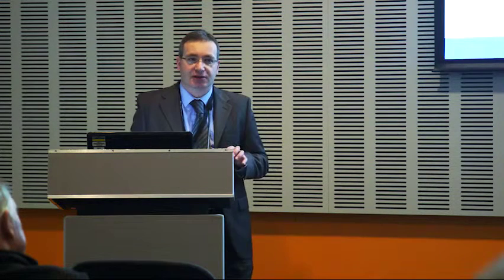So our traditional understanding of the corneal topography is actually rather limited. What we want to be thinking more about in terms of contact lens practice, certainly in terms of specialist contact lens practice, and certainly in terms of scleral contact lens fitting, is to consider the whole ocular profile. So what we want to do is move away from this corneal model in our minds to a completely ocular profile.